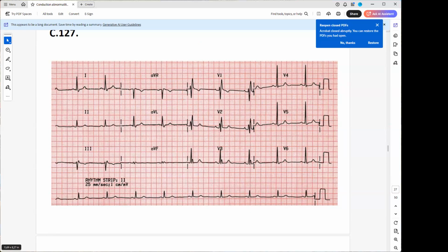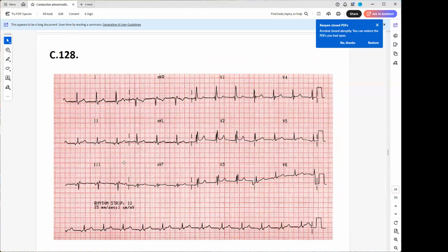Okay, 127, 128. Maria? Hi, Professor. Hi there. Okay, so that should be 128, yes? Yeah. Oh boy, interesting ECG.